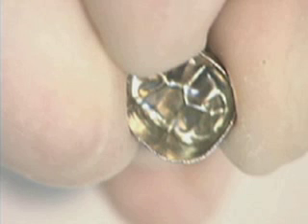Lift the crown off again. By shortening the crown length we have removed the knife edge finish it had. You can see there is a blunt margin where the stainless steel crown adapts to the tooth. Use the heatless stone at an angle to recreate the knife edge in the last 1 mm of the crown — we are not shortening it, just recreating a knife edge finish to the margin. Then switch to a burlew wheel and repeat the same thing, creating a smooth polished finish that removes scratches and polishes the bevel.